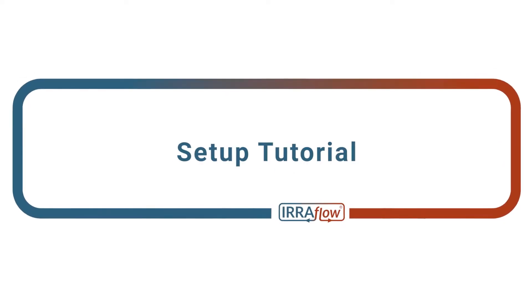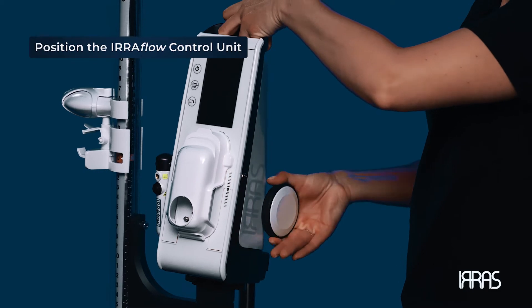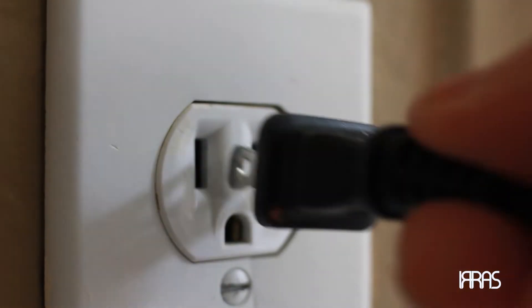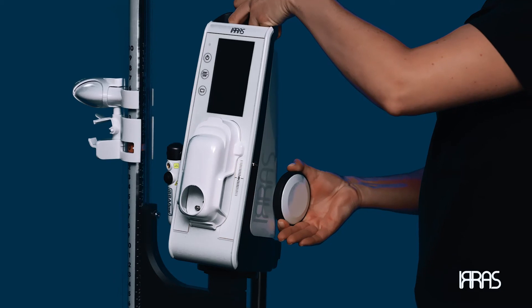Chapter 2 Setup Tutorial. Position the IRRAflow control unit onto the IV pole using the roller pole clamp. Pay attention to ensure the control unit is plugged into an approved electrical outlet and the pole clamp is fully tightened.